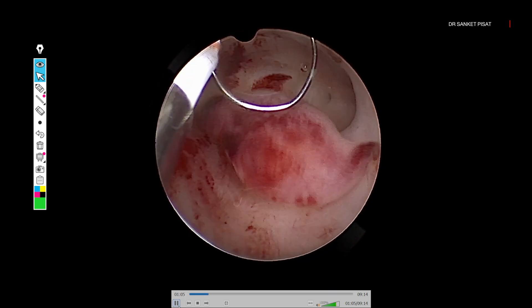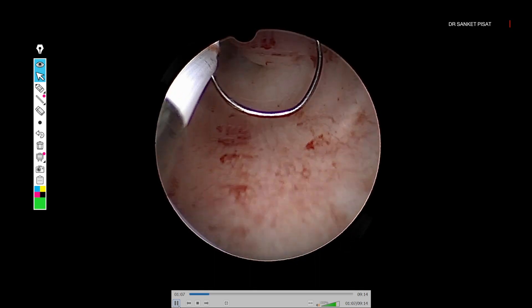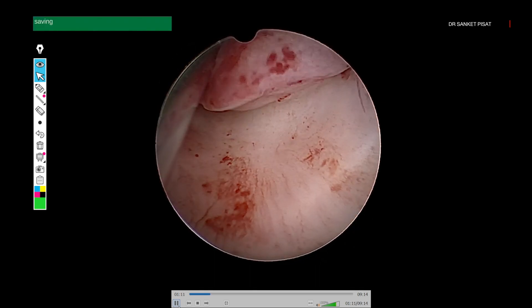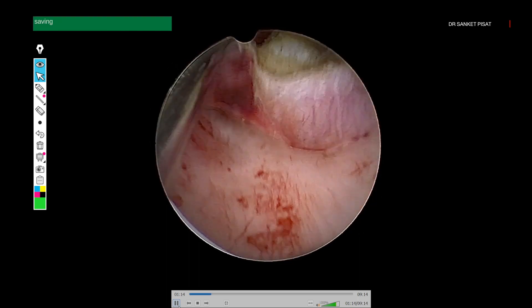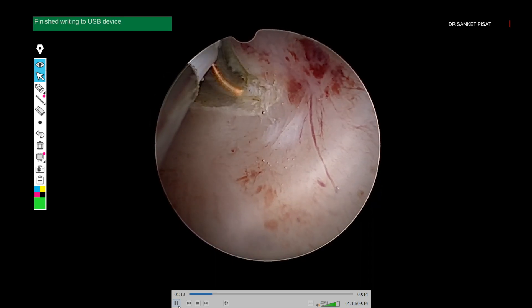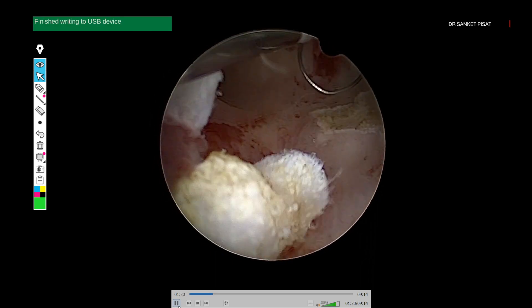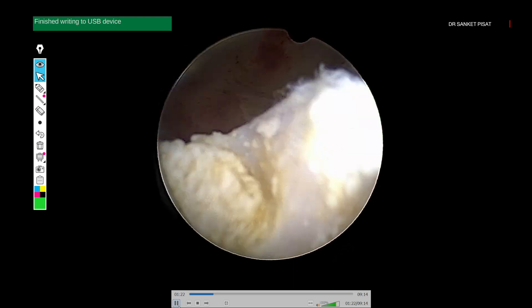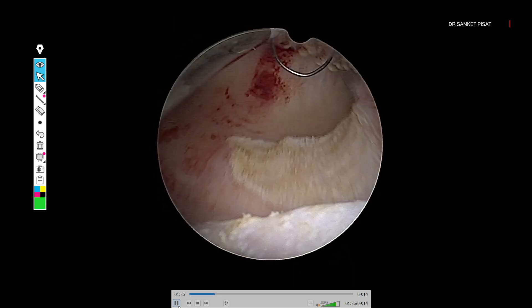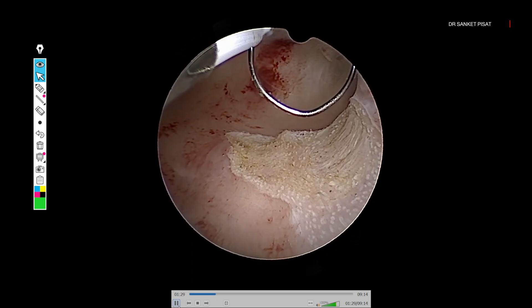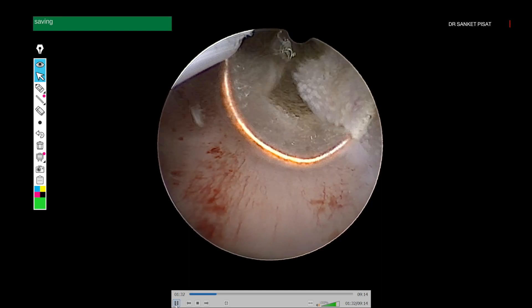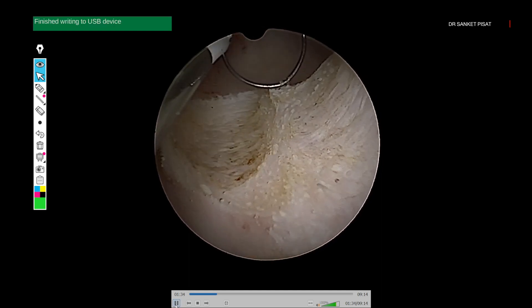I have now gone in with the resectoscope loop and first I choose to shave off the polyp. The resectoscope loop has to go beyond the pathology which you want to cut, and then we cut it. We use an Allen resectoscope and an Allen energy source unit which gives very good cutting. I usually use it at anywhere between 100 to 120 watts of pure cutting current. You can now see that the polyp has been shaved off.